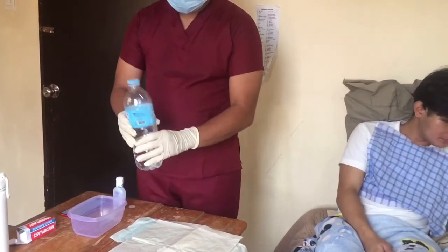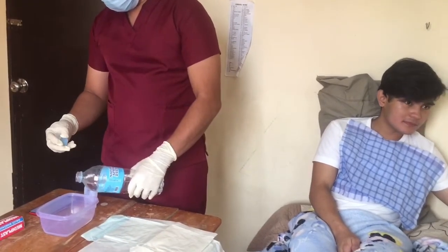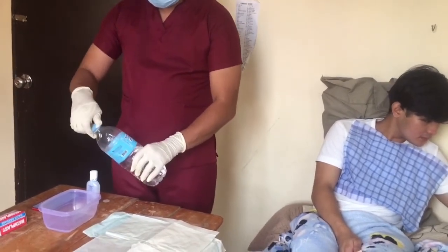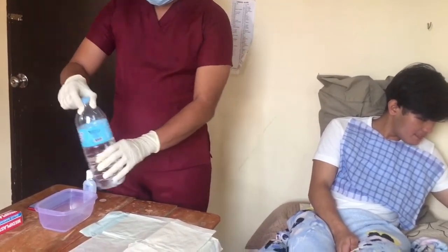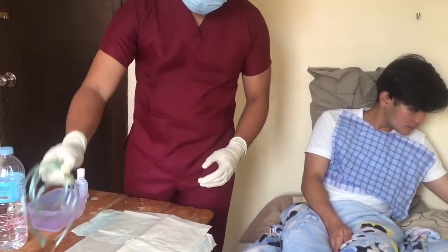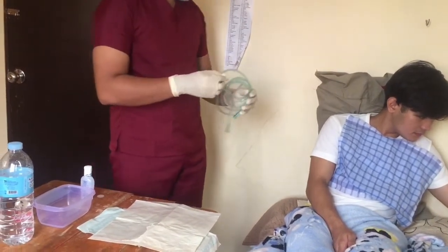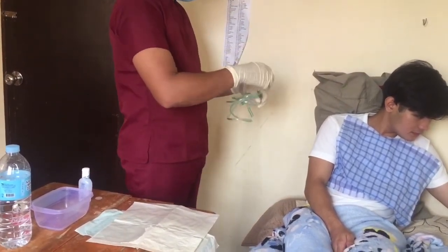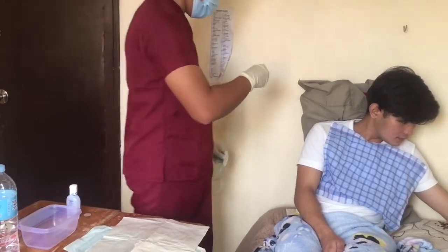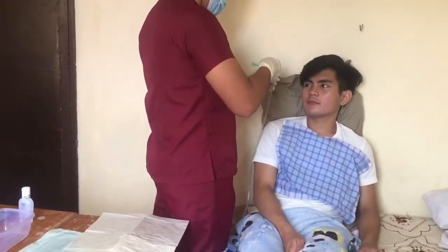Pour sterile water or saline into the container. This is for easy access when you use it in the procedure, to save time and effort. Measure the distance between the tip of the client's nose and the earlobe, or about 13 cm, in order to have a proper measurement of the catheter to the patient's nose.